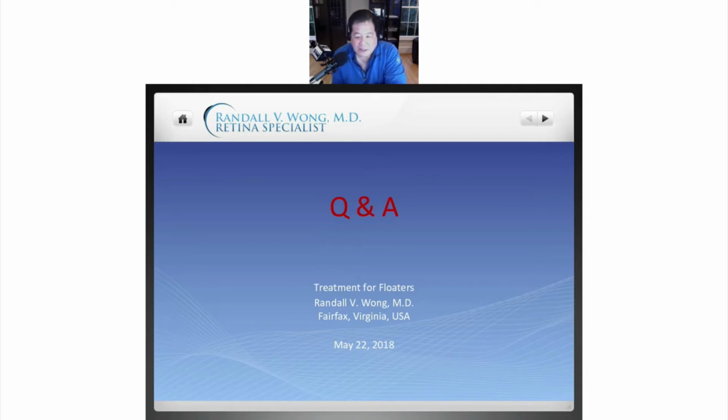Sarah says, is frill around the IOL or off in the periphery somewhere? Is it attached to the crystalline lens? Frill, in my opinion, as far as I can tell, is the border where I stopped cutting vitreous off to the side. Has nothing to do with vitreous attached to the normal lens, which is also known as the crystalline lens.